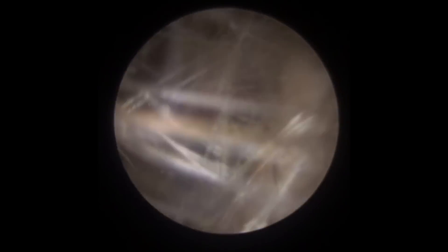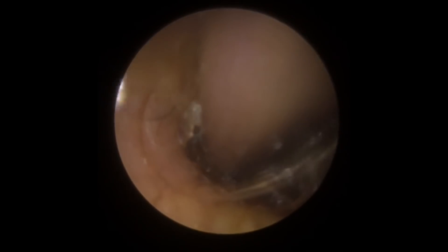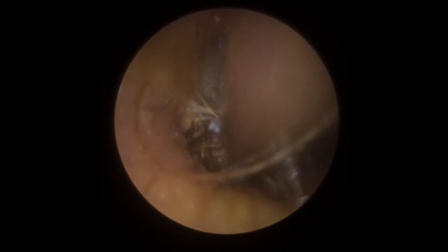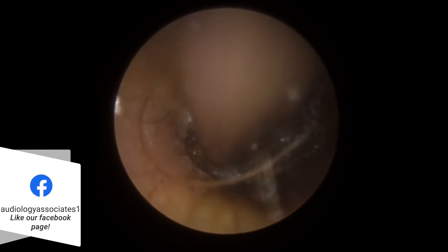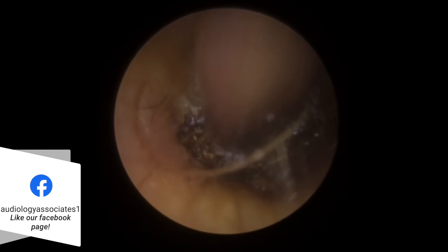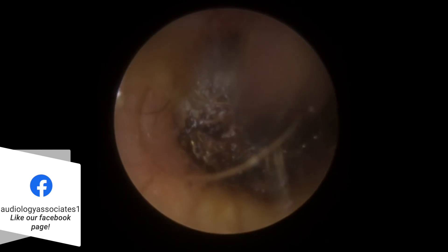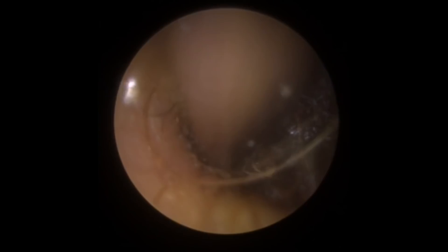Just trying to find anywhere around the edge here. This is the downside of olive oil — sometimes it'll flick across the camera so it does make it a little bit more difficult to remove. We're just working on this left hand side again, trying to pull from the left to the right. You can see a little bit of movement starting in the wax blockage there — slowly pulling this across. You can see it's crumbling and how dry it is, all starting to crumble and break down while it's impregnated with that olive oil.